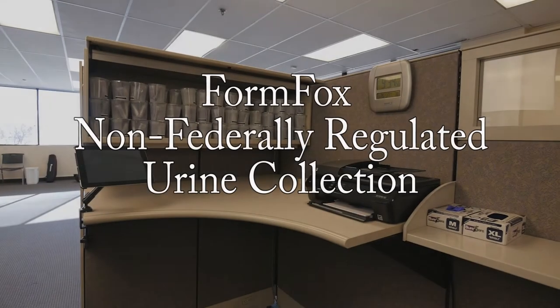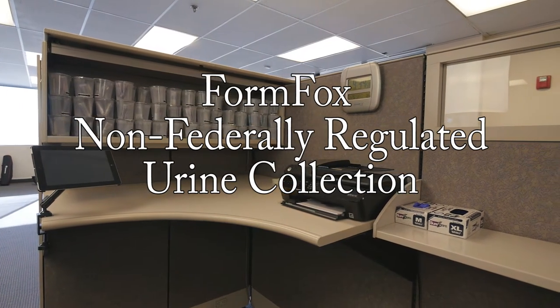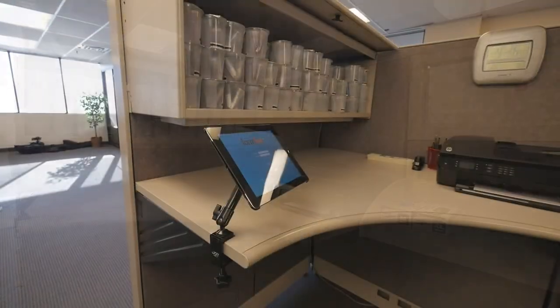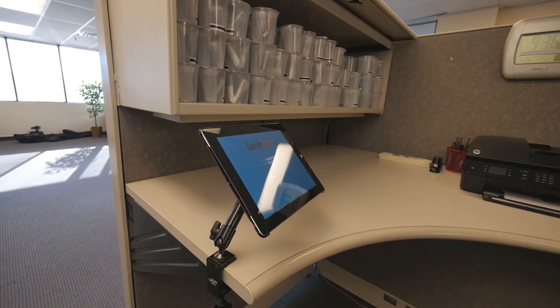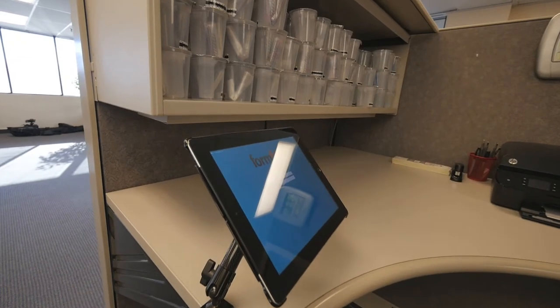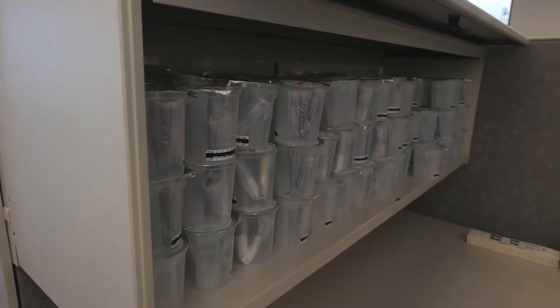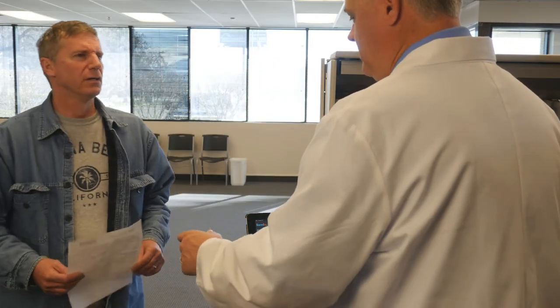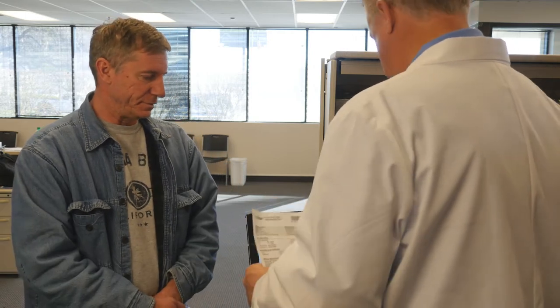Welcome to the FormFox lab-based urine collection user training module. This training is designed to help users understand the basics of using FormFox for a non-federally regulated urine collection with the FormFox system, and assumes that the user has some working knowledge of the specimen collection process. We will be starting the collection using the account number button. Refer to the Getting Started training module for information about other ways to start an exam or collection event.